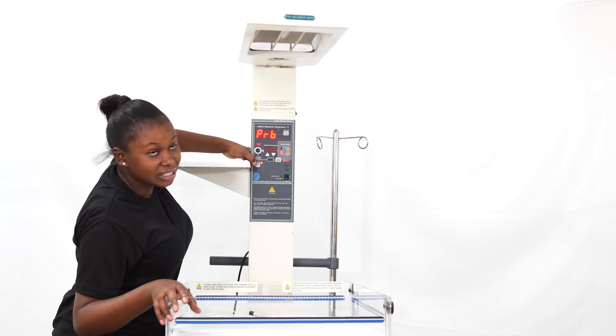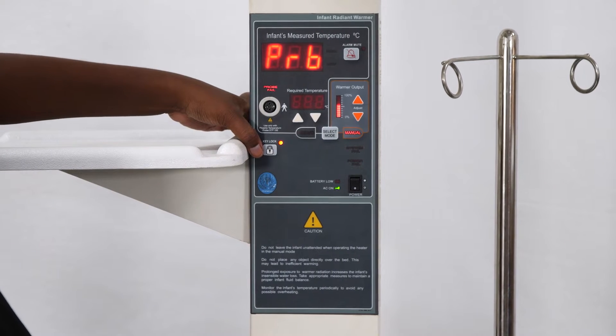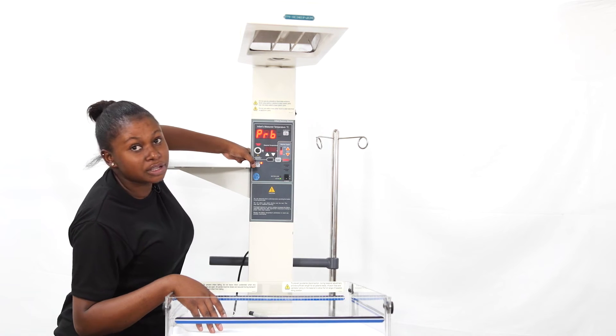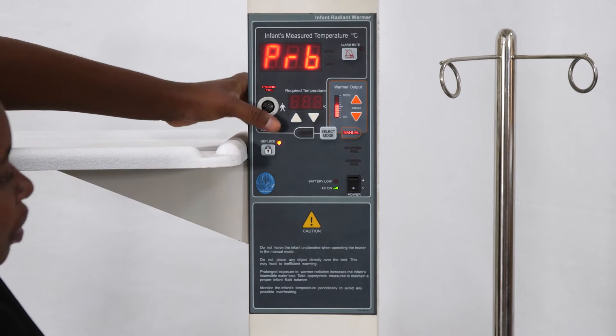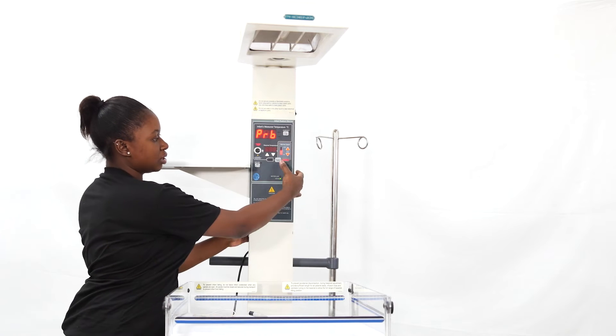First of all, there is a lock button. The lock button prevents the settings being changed accidentally. So to change modes, you first have to turn off the lock. You press that lock button and you select the mode.